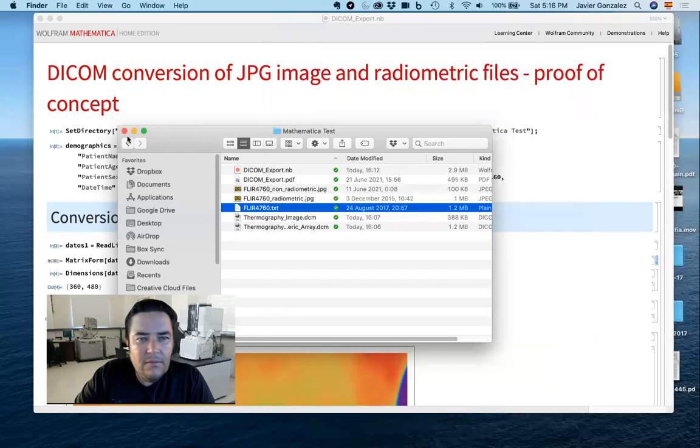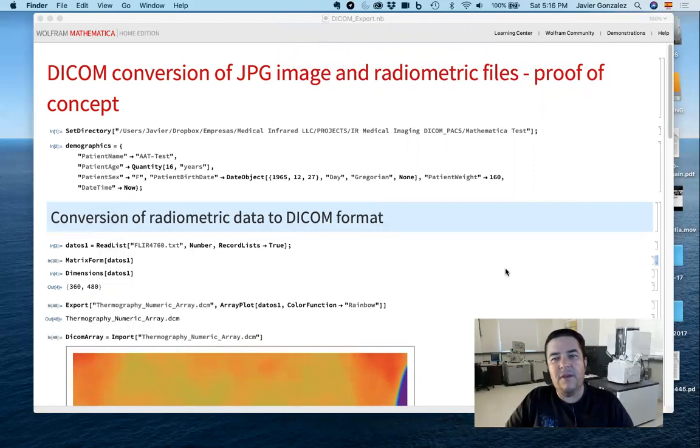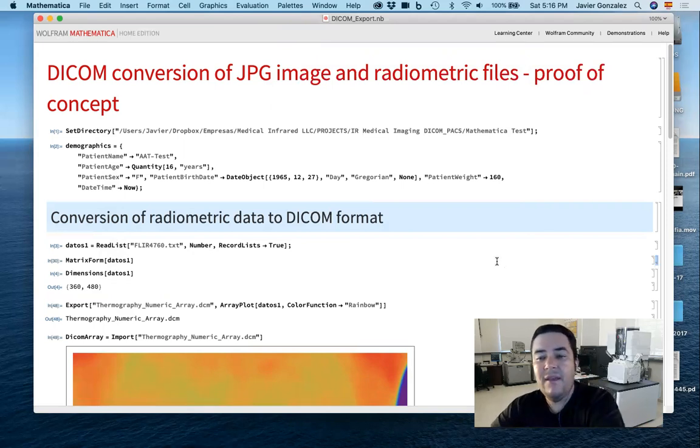And here's my DICOM conversion proof of concept. First, I used Mathematica. Most programming languages have a DICOM interface. So you don't have to program a lot if you know what you're doing. I'm not a software developer, so I use high-level programming languages just to make pseudocode and just to show what needs to be done, so that a software developer can later do it.